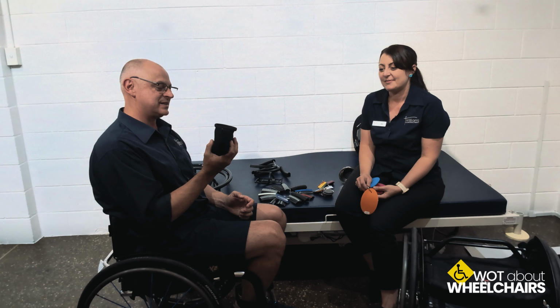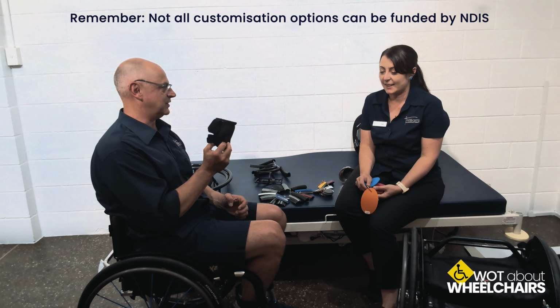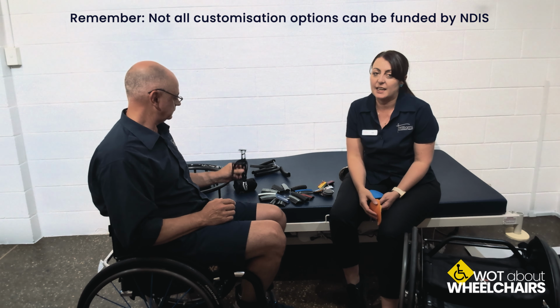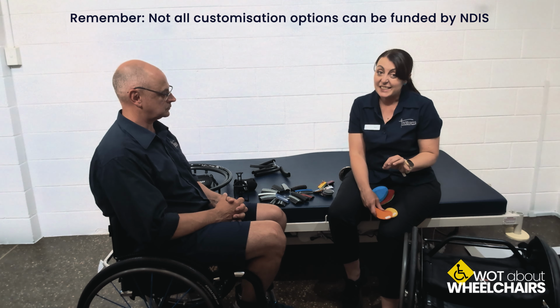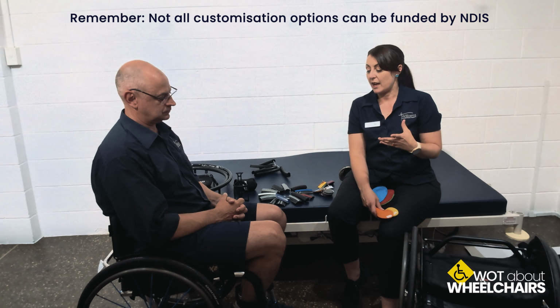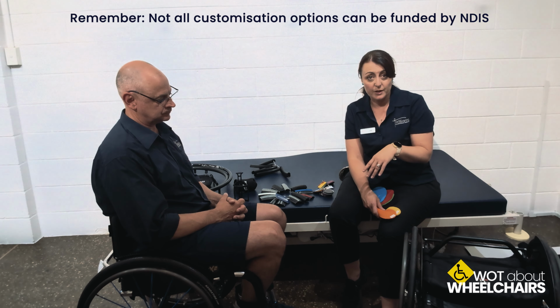The one thing that was explained to us at the start is the little fancy stuff might not get funded by NDIS. Can you explain that for us, Kat? Yeah, one of the key components, and this is why we go through so much detail when we're planning a new wheelchair and doing an application, is it needs to be reasonable, it needs to be necessary, and it needs to meet the person's disability needs. If it is not essential that you have those extra add-ons, then we don't want your application to get rejected for funding because we've put on all of these optional extras.